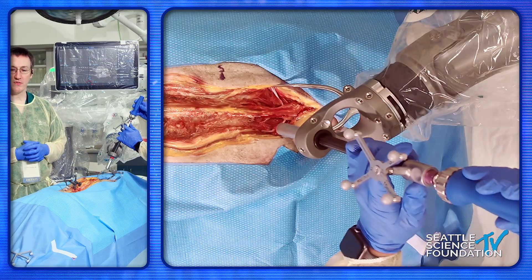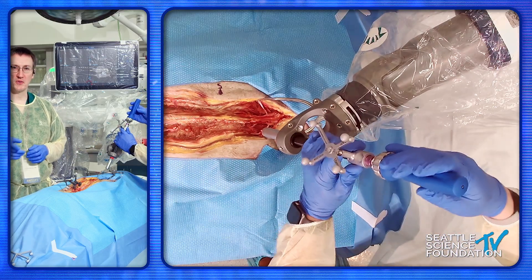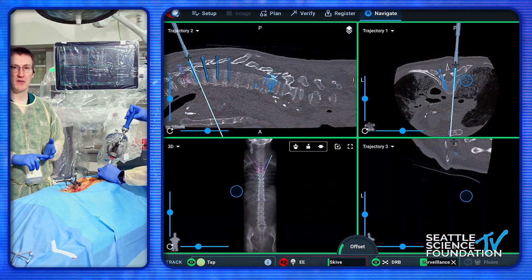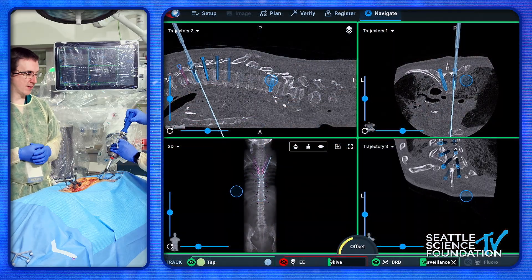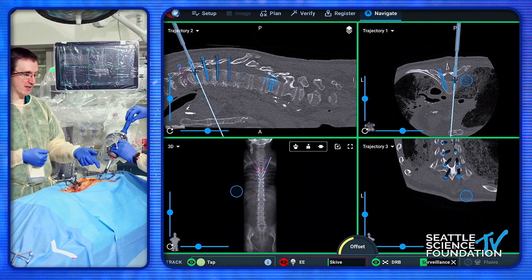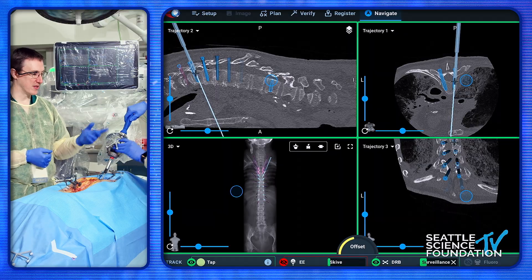I prefer to tap the screw hole. However, we're using very narrow screws here, so when I get to 4.5s and 5.5s I generally don't tap. But when I'm at 6.5, 7.5, 8.5, 9.5, 10.5 — I am going to tap. So this is how we would do it, but we're just going to make a little bit here for the demonstration.